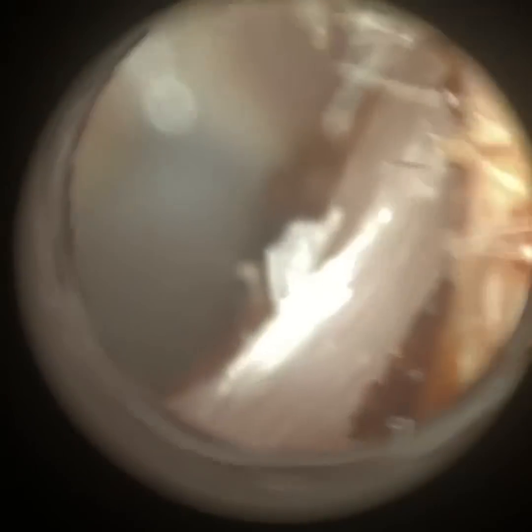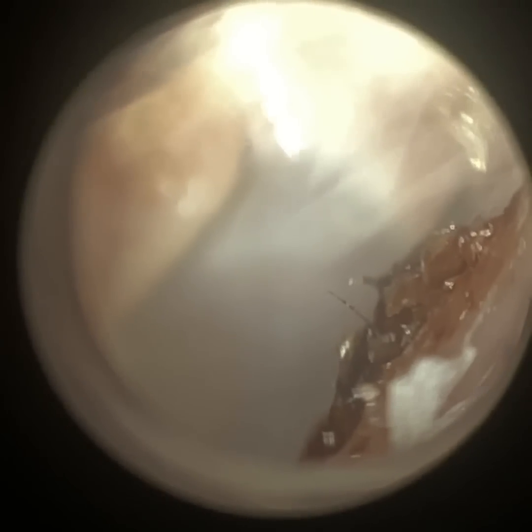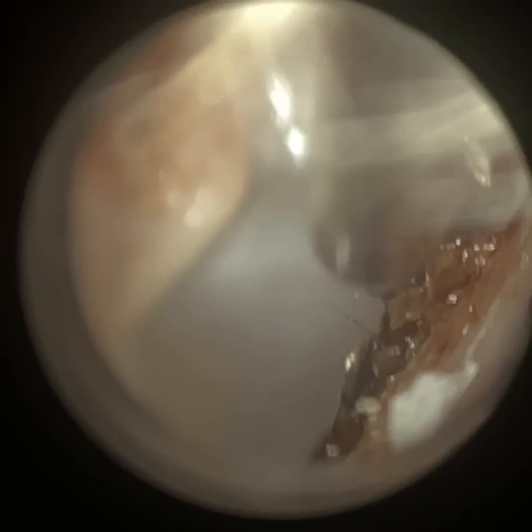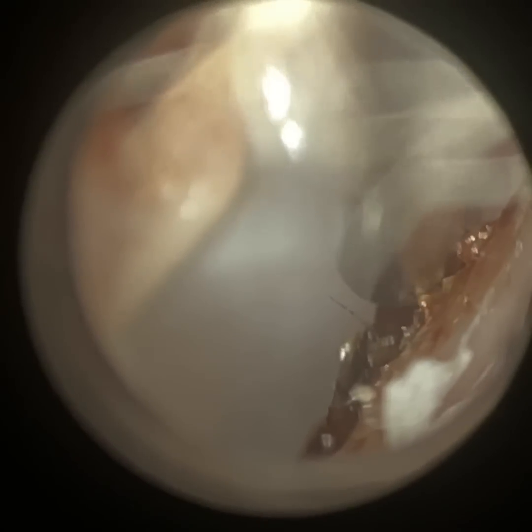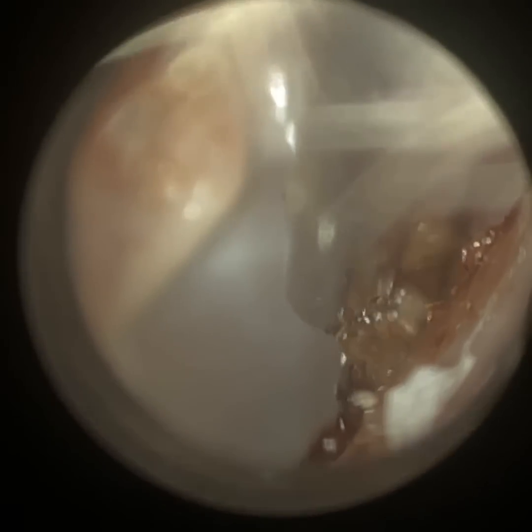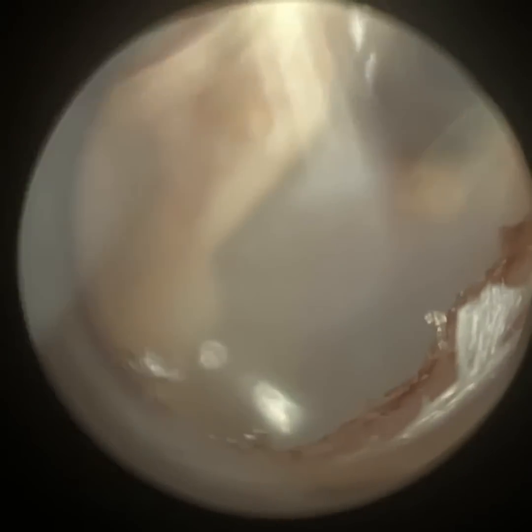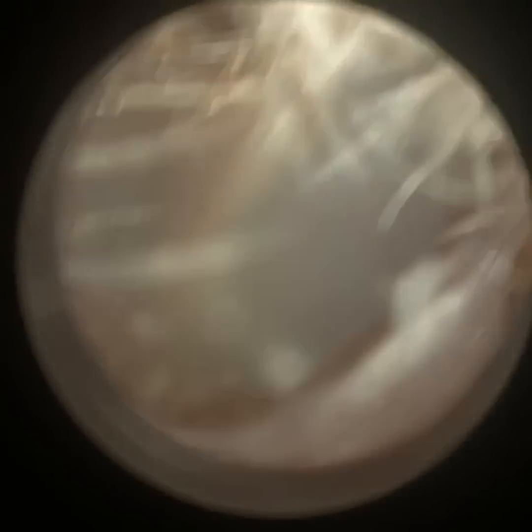I'm just going to stretch the ear open again, past the second bend with the speculum on the right hand side. That's the key thing when using a speculum for wax removal. We need to make sure you've got the speculum in the most comfortable position for the patient. And it typically means the right hand side of the speculum is tucked in from the second bend. And it's not always possible.